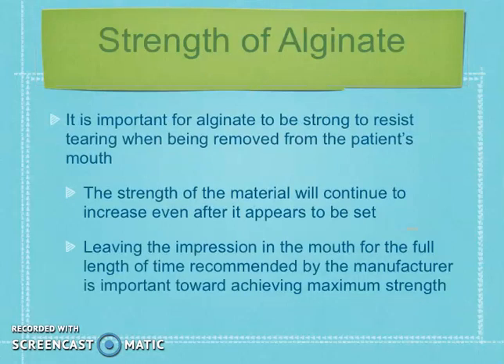The strength of the alginate is not very strong. Therefore, we need to be careful. We need to try to do all that we can to keep it from tearing when you remove it from the patient's mouth. So the strength in the material will continue to increase even after it appears to be set. So leaving it setting for a little bit longer is a good thing. We should not remove it from the mouth too quickly.